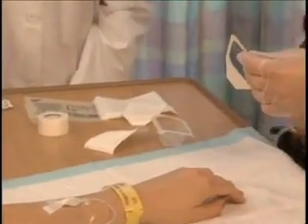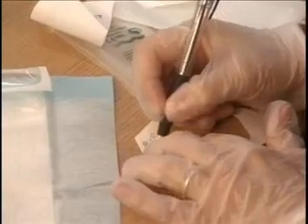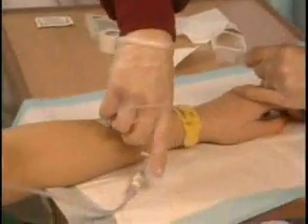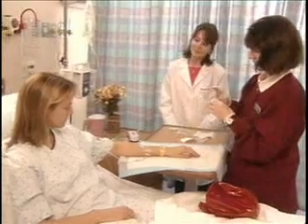Now for the label: date, time, and initials. Now I'll apply the label, and I'll secure the tubing.